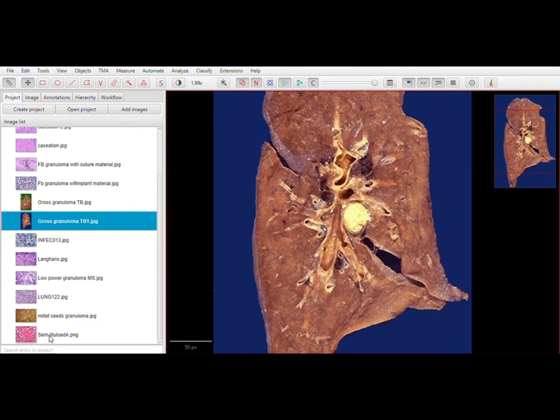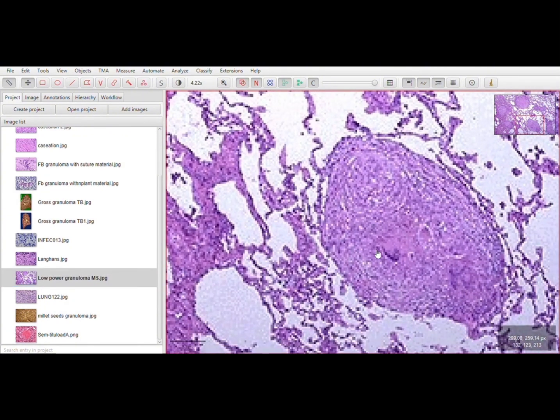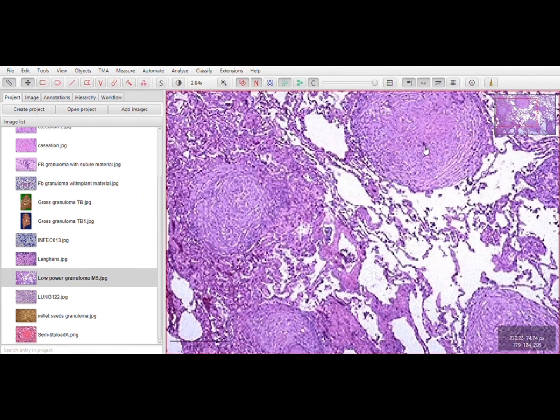Talking about the microscopic aspect of granuloma, on low magnification of a tissue slide of lung parenchyma, the whitish background is lung parenchyma with all the air spaces. But in air spaces, you don't normally expect solidified areas. Here you can see solidified and very well circumscribed areas, maybe six of them. When you go for a closer look, you can also see certain giant cells present. Another giant cell, another giant cell.